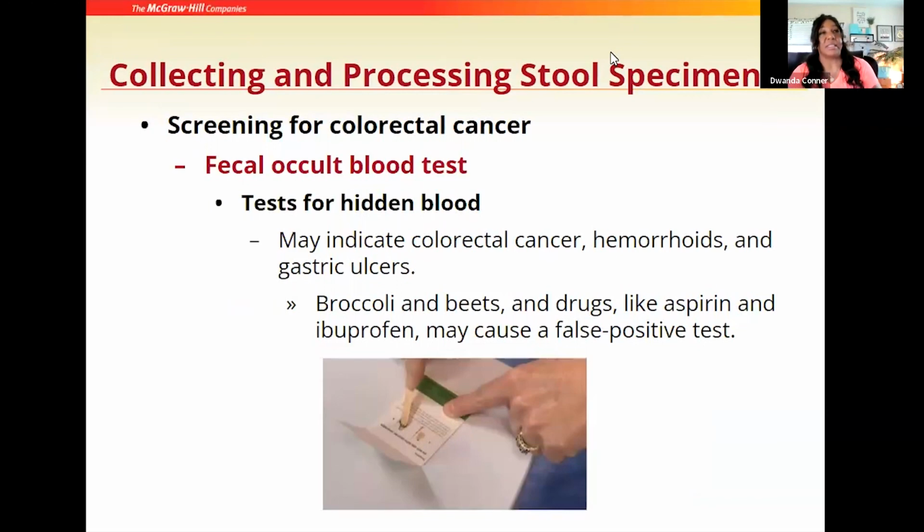Also falling within a CCMA scope of practice is the ability to collect and process stool specimens. Now, collecting and processing stool specimens is going to come with its own set of patient instructions because this is also a test that we can send home with the patients to complete at their earliest convenience. Why we would collect and process stool specimens is this could be a screening for what's called colorectal cancer.